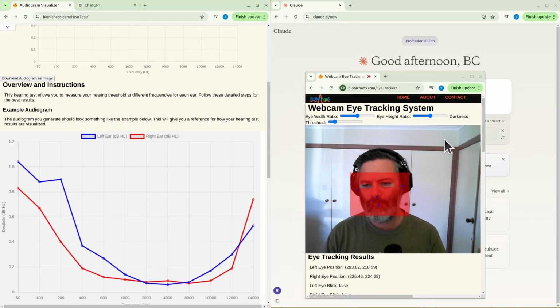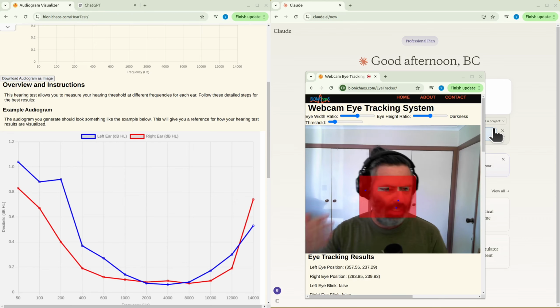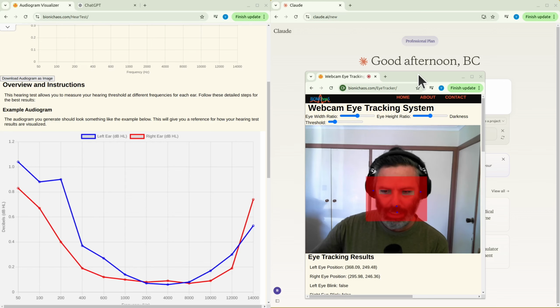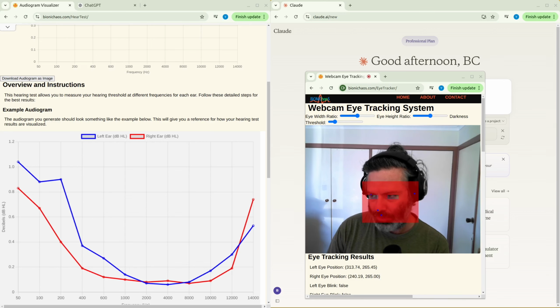Updating the hearing test tool to export the audiogram as JSON sounds like a solid plan. For development, you can mock up the JSON data to represent different hearing profiles. Would you like to outline the structure of this JSON data for your developer? No, I'll let the developer sort it out. Can we outline the whole web application structure first?